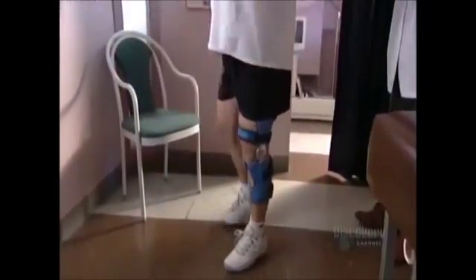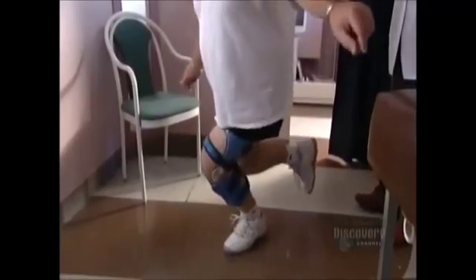Finally, they attach straps to fasten the orthosis to the leg. The orthotist checks the fit on the patient, then runs various tests to make sure the orthosis is doing exactly what it's designed to do.